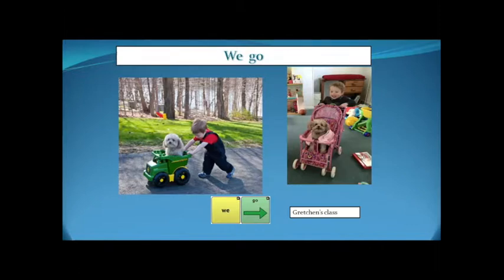She knows the kid's going to be interested because it's all about them. And what she's really doing is teaching the paraprofessional how to use the device. So then the paraprofessional, without being told, go figure out how to say "we go" on here, actually has the pathway and they can do it.